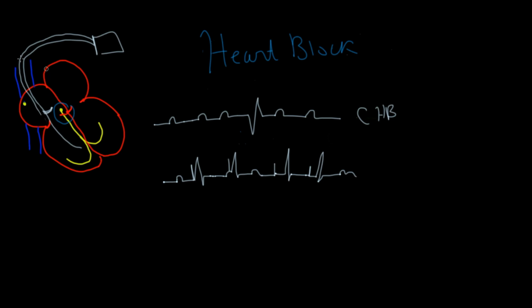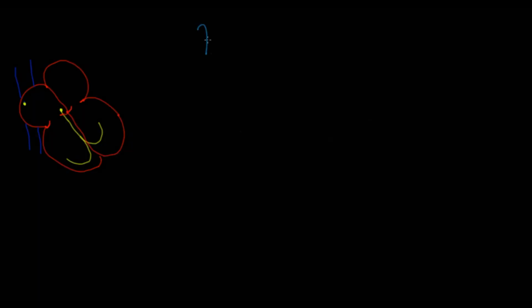Right, so we have now an atrial lead and a ventricular lead. And the beauty of that is, because now we have two leads, the pacemaker can use these beautiful P waves that happen in there as a source of information. So if the patient increases the heart rate, then we have much better exercise tolerance at this stage. Next, we're talking about heart failure and pacemaker.